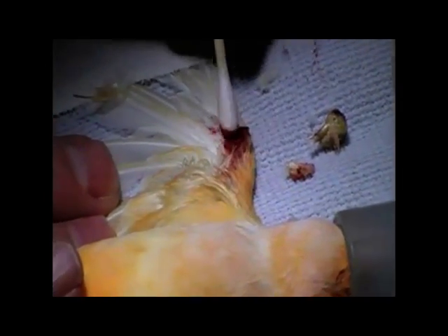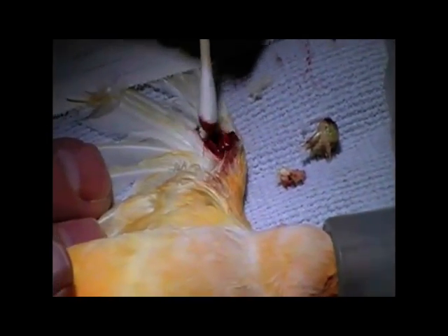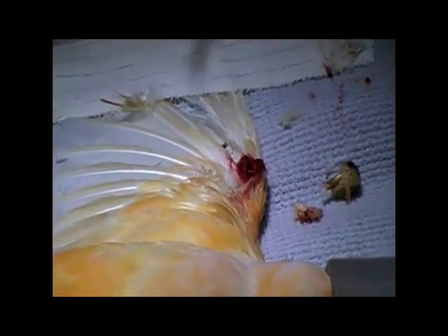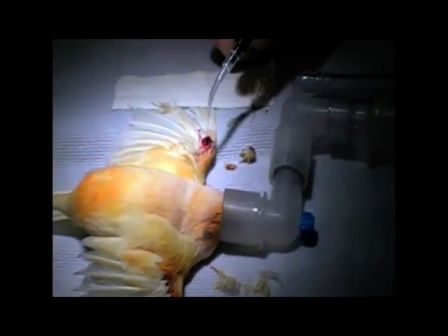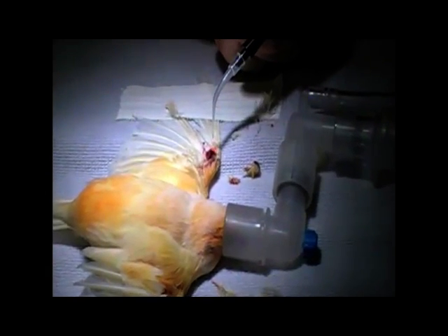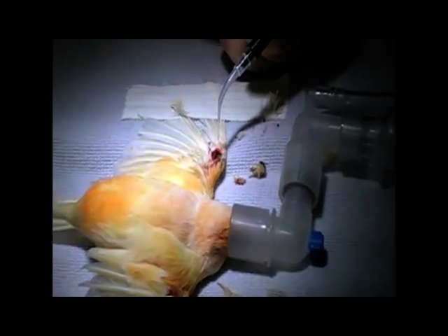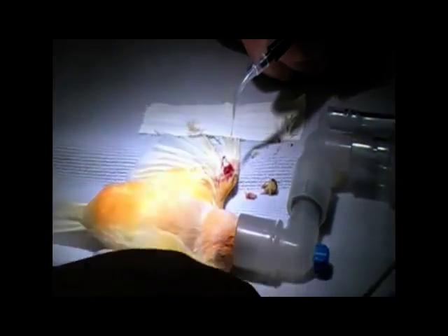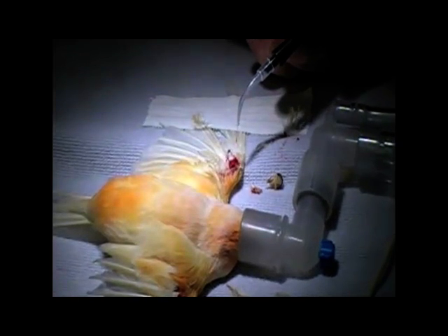I'm going to apply the laser to this area, but I'll stand it back a little bit to see that contract down. See how that is just kind of sizzling all down, contracting, a little bit of smoke, a little bit of charring. Then just close that follicle opening right up. I'll back away a bit further and do some at a greater distance — you can see that close right up. That collagen will contract and close up.